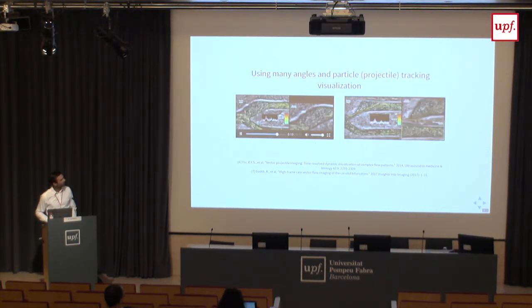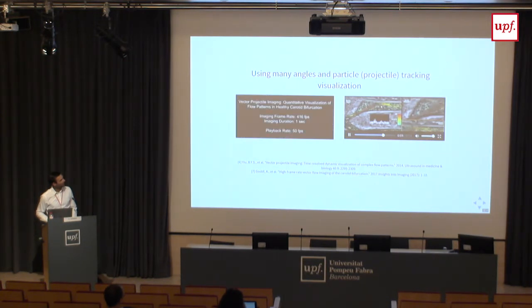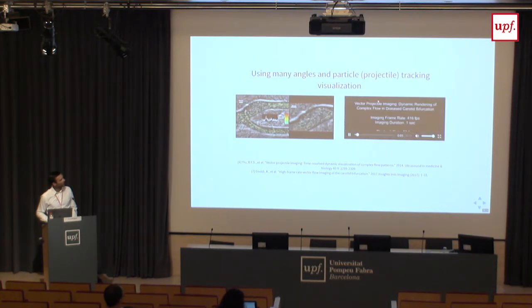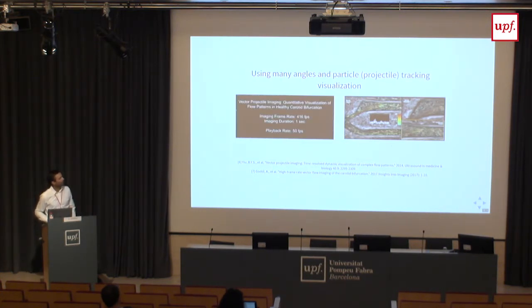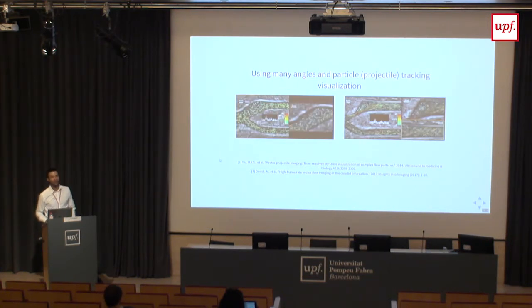But you can see in this case, actually, there is a clot here. So the flow cannot pass by properly. It accelerates abnormally. It will produce a lot of stress in the upper wall. But if you don't have that, the flow will be good. And this is measured with ultrasound. I hope you agree that this is actually very nice. And if you can have this in the clinic, of course, I don't think it's implemented yet, but it will be shortly for sure. So this would be very useful.